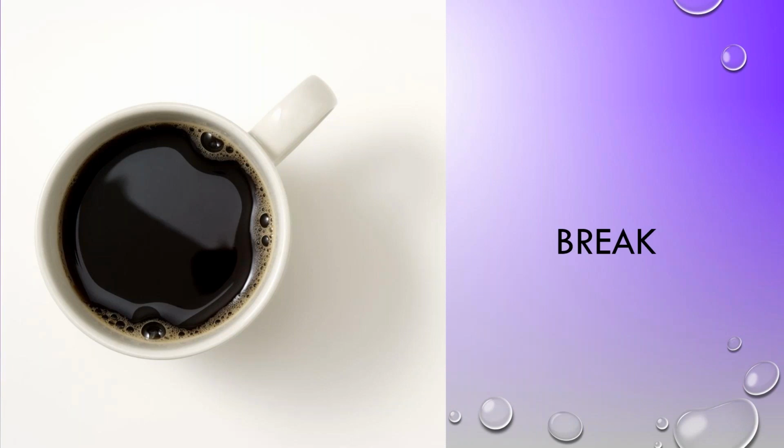And in the Dräger ventilators, which we will be covering in the next session on June 9th, I will be demonstrating a ventilation adjunct mode called volume guarantee, which delivers the tidal volume at the minimum pressure required. So we are targeting the volume, and thus avoiding the volume trauma. But we are also delivering tidal volume at the lowest possible pressure, thus reducing the barotrauma.